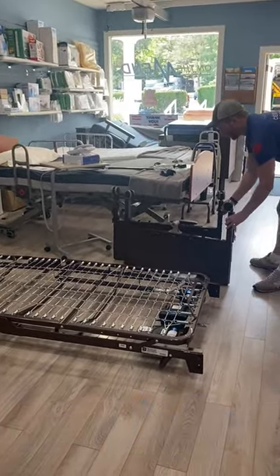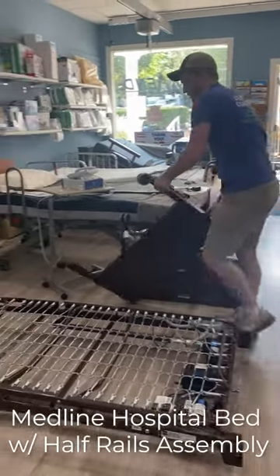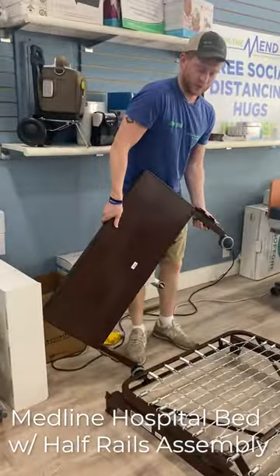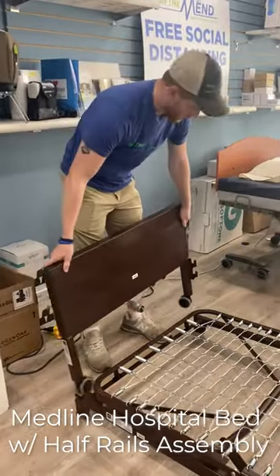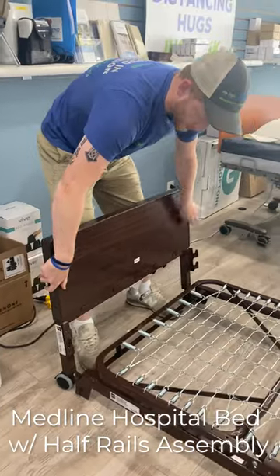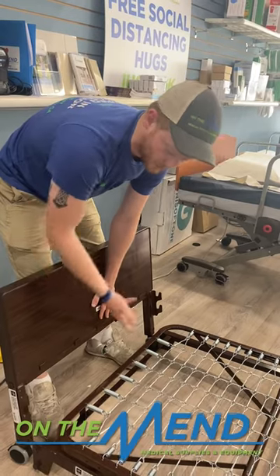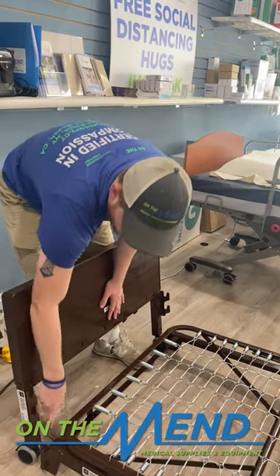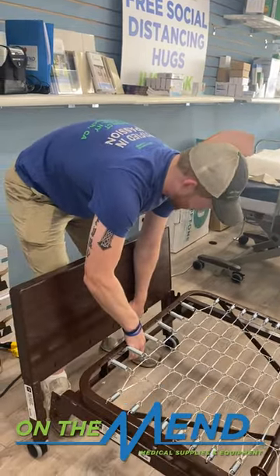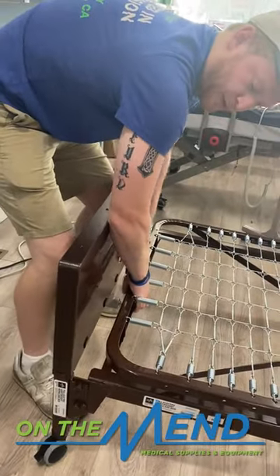They should be labeled head or foot. If they're not, the head is normally taller than the foot on most beds. On this one they're pretty even, but just keep that in mind. It doesn't matter which one you start with — I'm going to start with the head. It might help to have the wheel locked so it's not running away from you while you're trying to put it on. You have to be pretty precise with this. It might be a little annoying at first, but once you get the hang of it, it's super easy. These are going to hook right in here, but you kind of have to go in evenly on both sides. I usually like to line up the bottom one and then the top one naturally will fall into place.